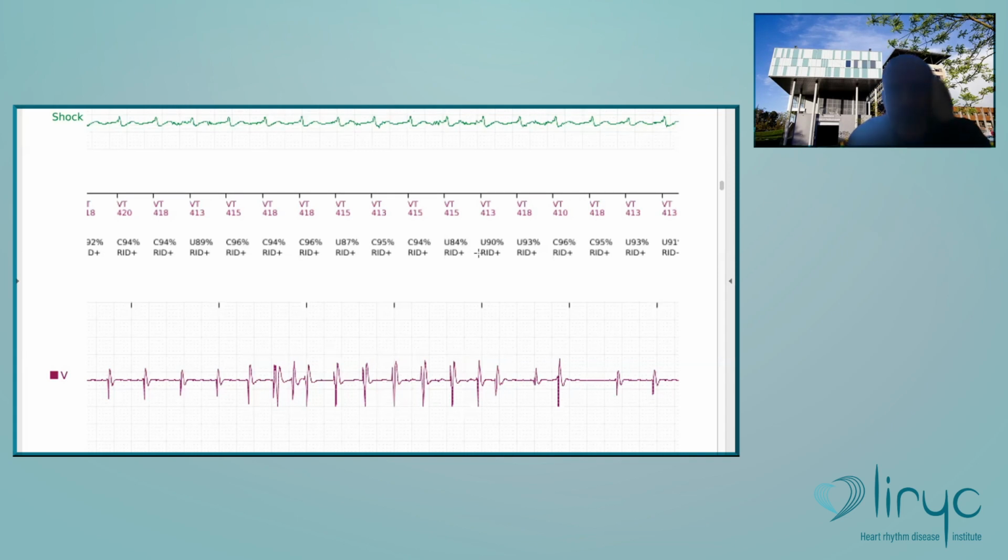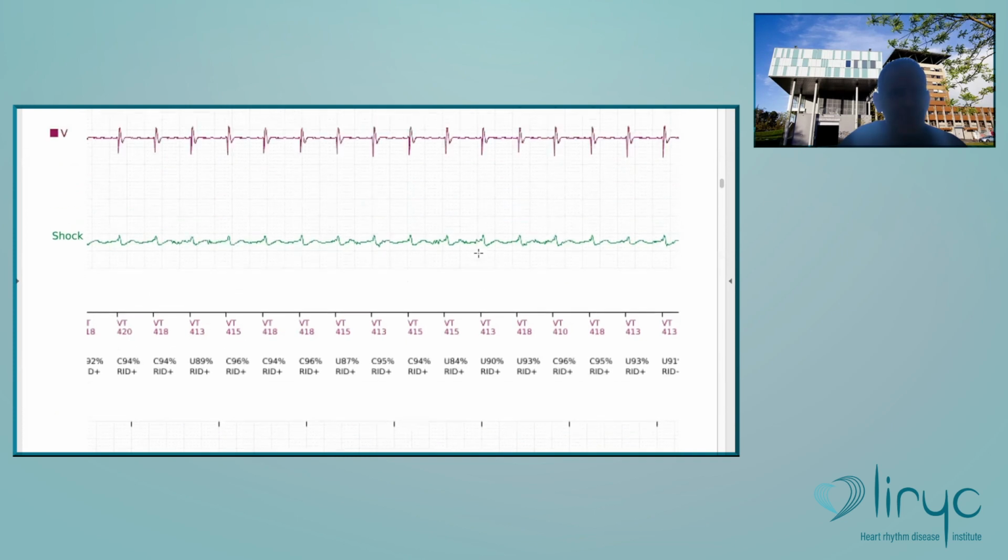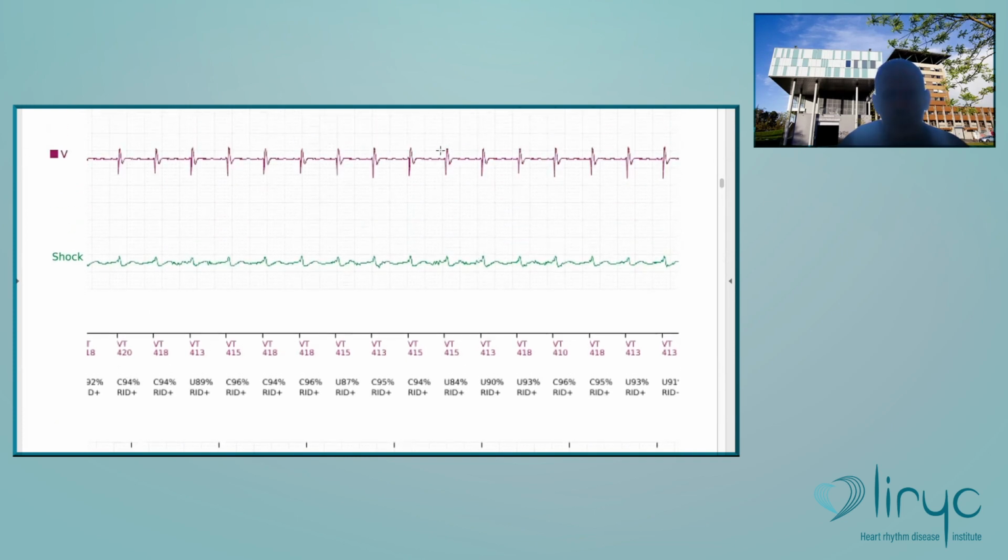And it's surprising to see that with Abbott, first I thought that it was exactly the same way. You know, in Abbott devices, it has been modified in the last versions. The very first platforms with morphology worked very poorly in Abbott, because all the discrimination on the morphology was based only on the bipolar channel signal.